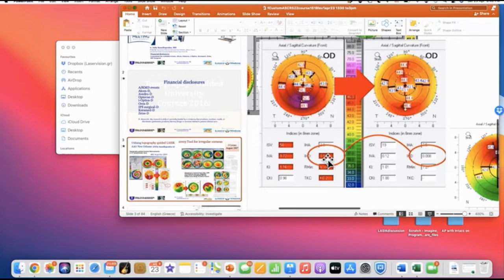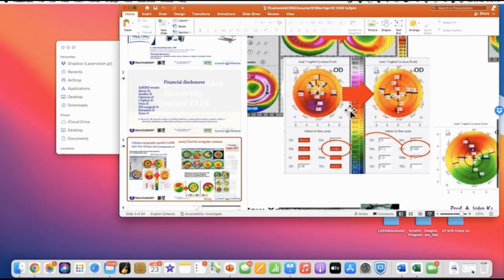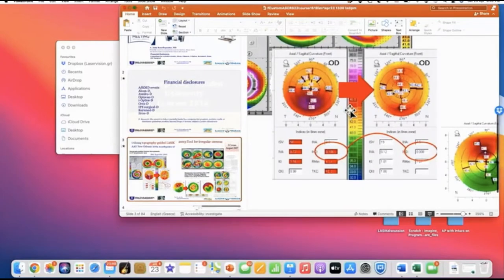The catch here is that, unfortunately, the IHD is not measuring total cornea power. It's measuring only anterior cornea power. So although the Pentacam is looking at mostly total cornea power, the topometric indices are designed to give you anterior cornea power. So we were able to basically normalize the IHD, make a stage 2 keratoconus to a non-keratoconic eye, and I think the picture speaks for itself. So we're seeing the dramatic and drastic improvement.